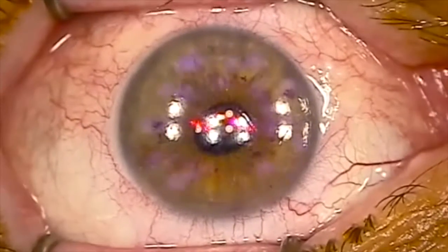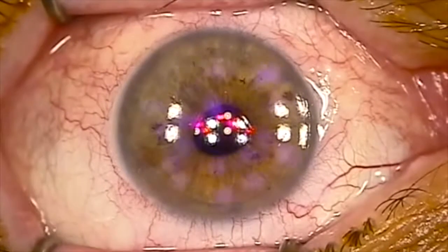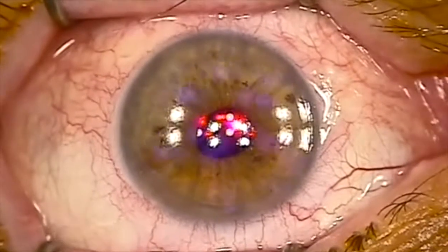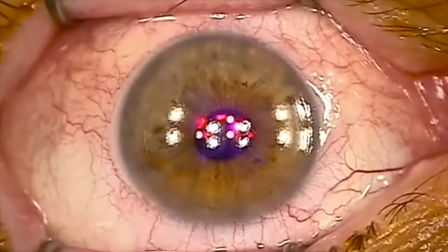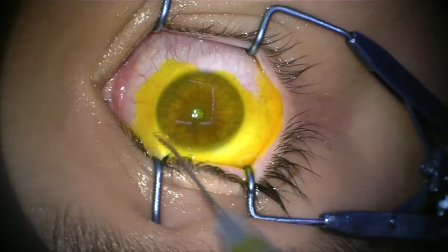If you've got health insurance, this procedure doesn't cost you anything at all as long as you're covered for the two item numbers associated with the laser and the collagen cross-linking. If you don't have insurance, there'll be a fee for it, and the staff at Queensland Eye Institute can give you a quote. You can see the laser finishing off there, and now I'll start to apply the riboflavin — the yellow vitamin B2 — to the cornea in this patient.